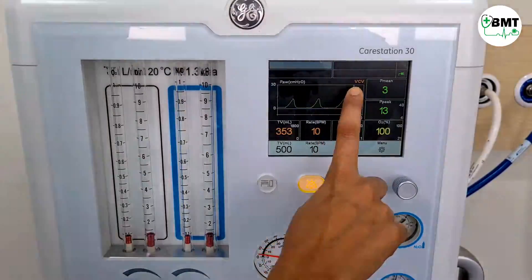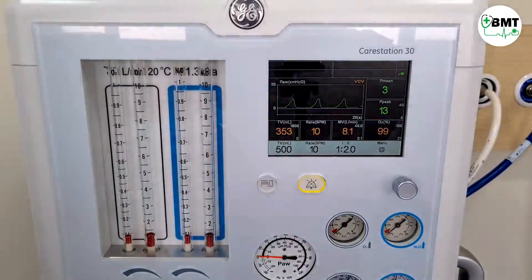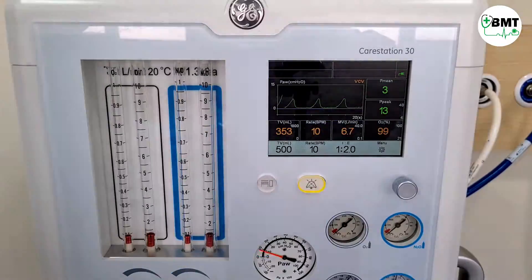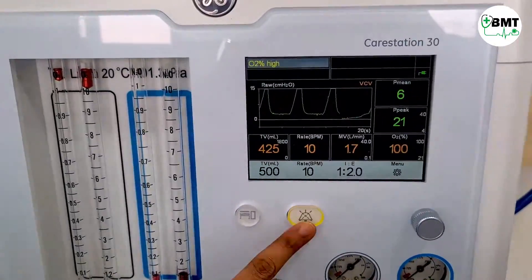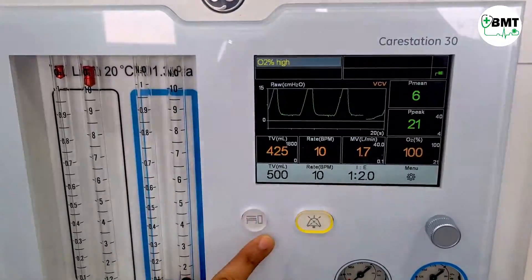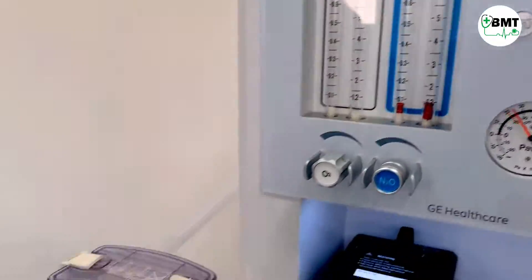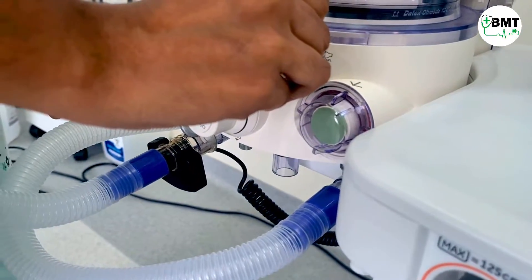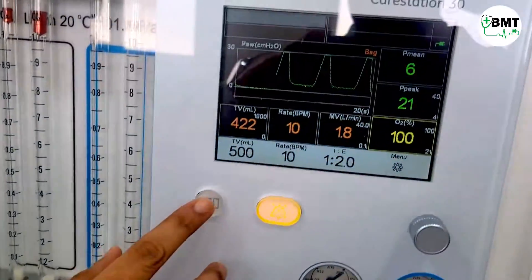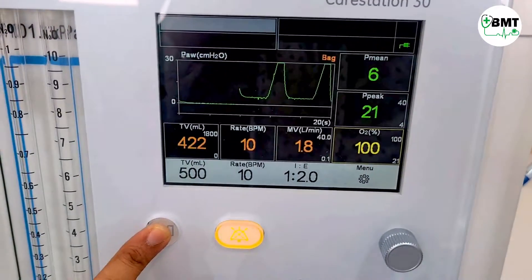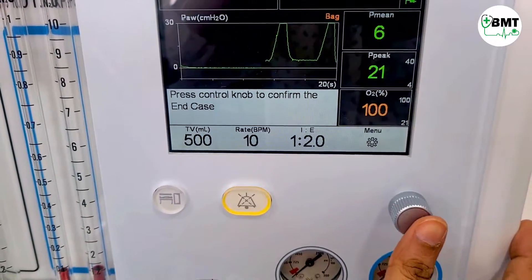Here you can see VCV mode — this machine contains only one mode, which is VCV (volume control). This is the alarm mute button and this is the end case button. The end case button works in bag mode. If the machine is in bag mode and you want to put it in standby, press the control knob to confirm the end case.